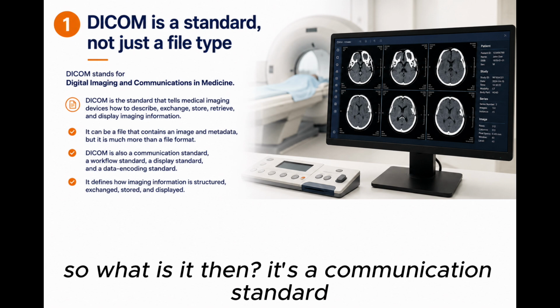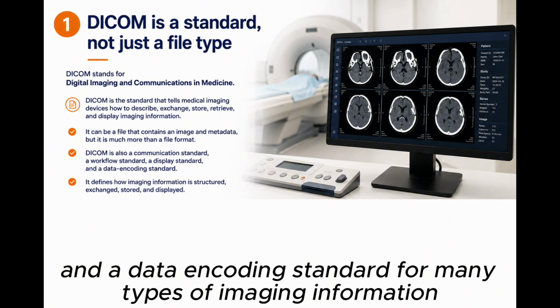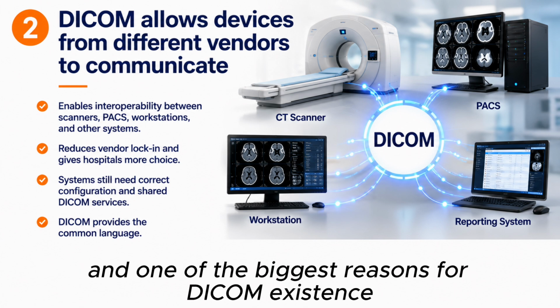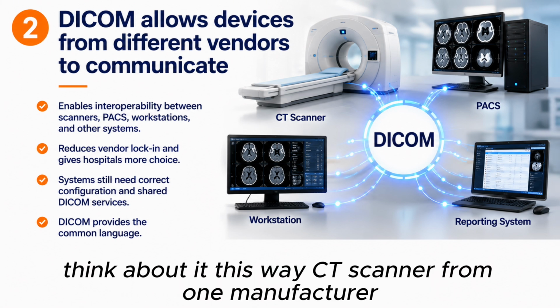So what is it then? It's a communication standard, a workflow standard, a display standard, and a data encoding standard for many types of imaging information. Think of it as a set of rules that devices can follow. These rules for communication are a really big deal, and one of the biggest reasons for DICOM's existence is what we call interoperability. Think about it this way.